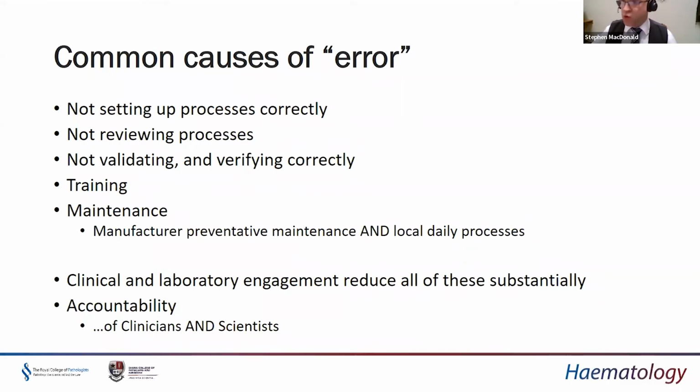We need to be monitoring that through our internal quality control and our external quality assurance, but we need to be doing preventative maintenance, much the same as people do with their cars, with services and MOTs and things like that. We have to maintain that standard periodically. It costs money, and it's money that never used to have to be spent in laboratories, but that's a conversation that you have to have with your finance department, and there's no avoiding it, because if you don't maintain your equipment, it will break, and if it doesn't break, possibly worse, it will start giving you bad results, which is potentially dangerous to patients.